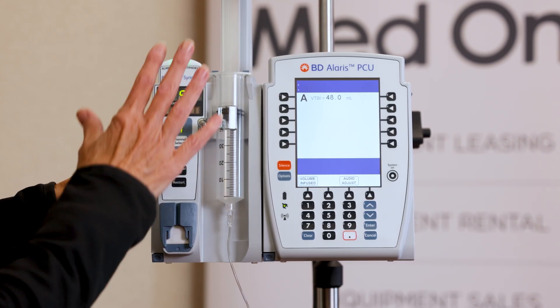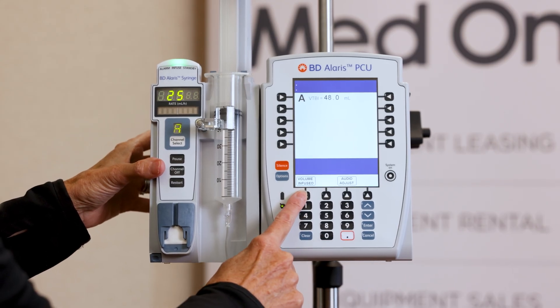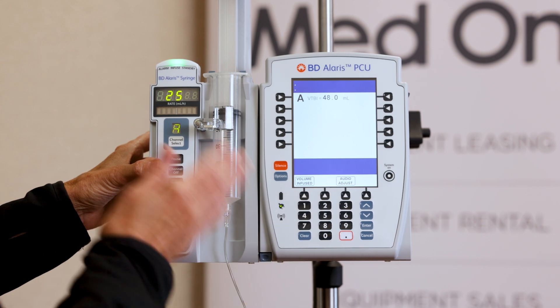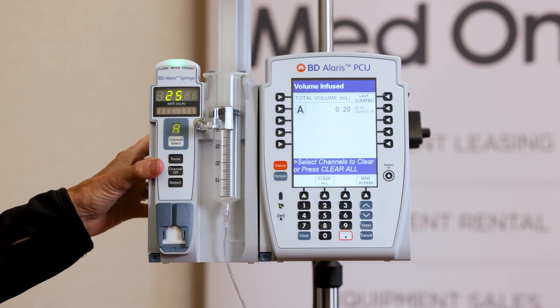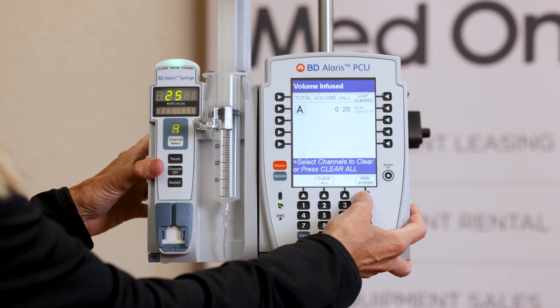While it's infusing, these two arrow keys correspond with volume infused and audio adjust. So if you want to see how much of your infusion has gone in, or you're ready to clear it, this is where you would do that. You would press clear all and then go back to your main screen.